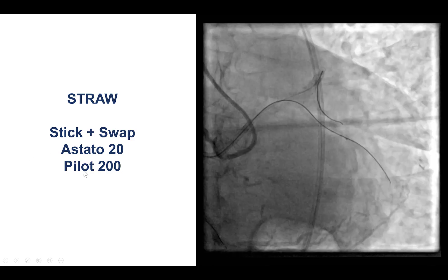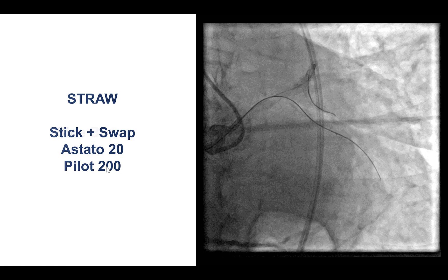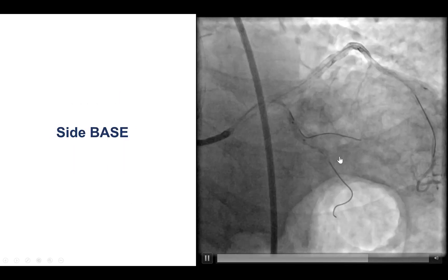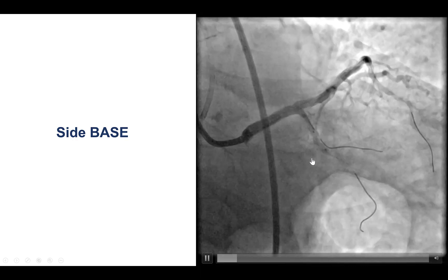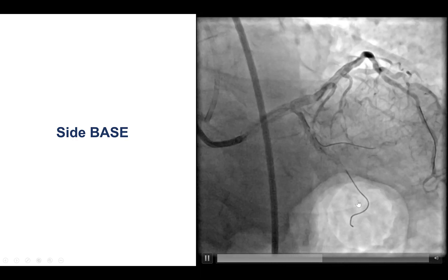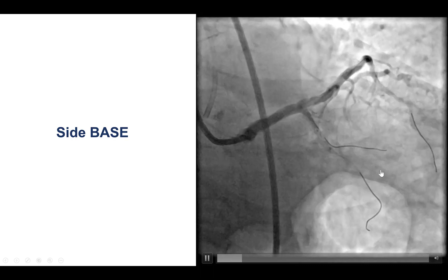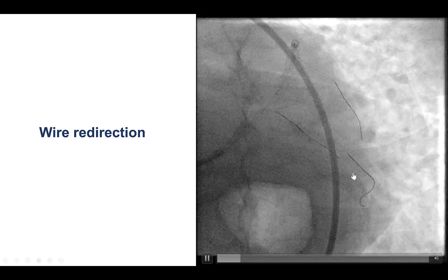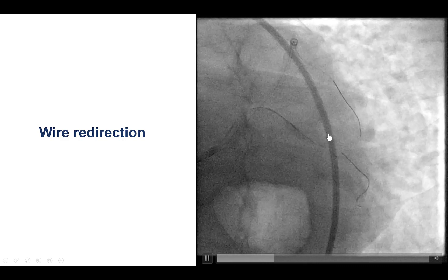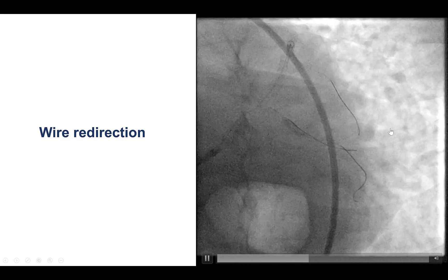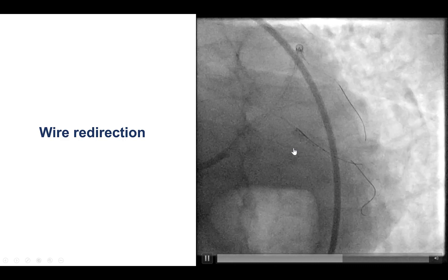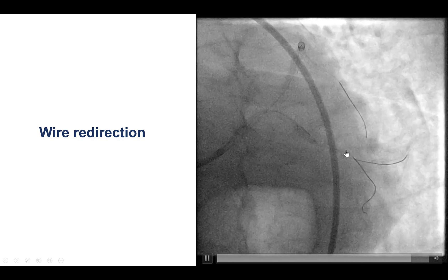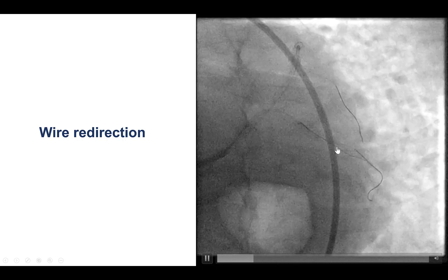We did the stick with an Astato 20 and the swap for the Pilot 200. The wire did actually enter into a branch, but this was the inferior branch of the obtuse marginal, not the main vessel going along the lateral wall of the heart. We had difficulty advancing a guidewire into the course of the obtuse marginal, but eventually, using the side-base technique — with a balloon inflated next to the origin of the inferior branch — we were working toward redirecting the wire.